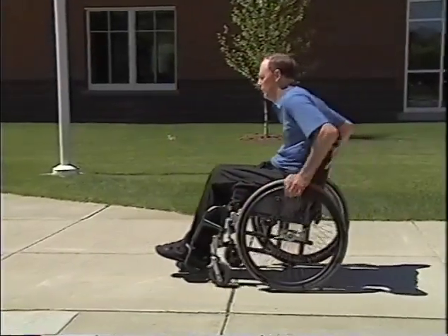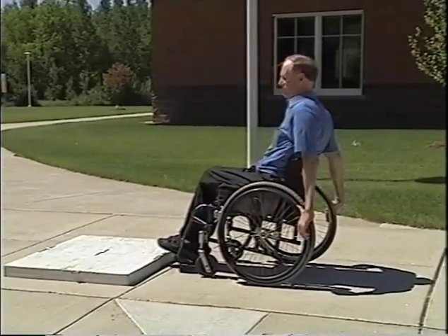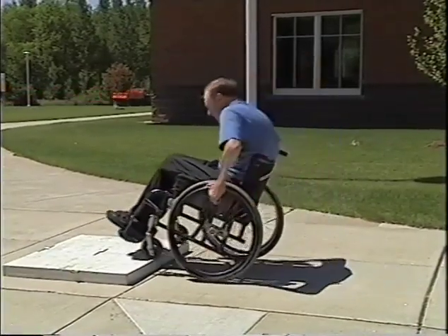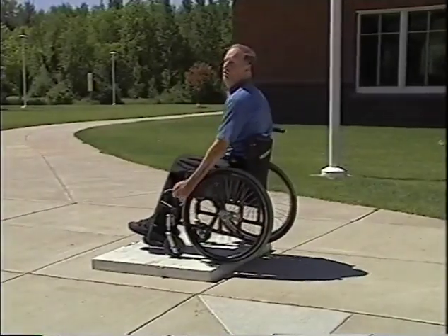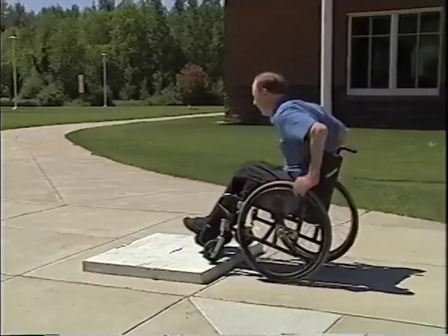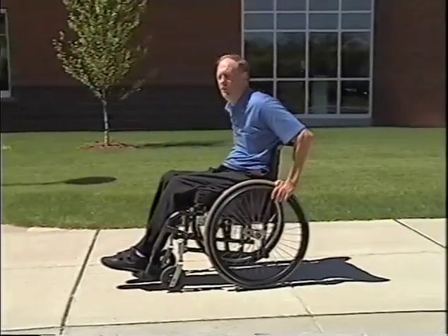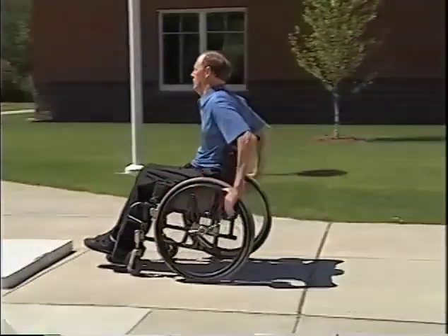So let's look at jumping up again. You want to be able to roll up right about here, leaning back, putting your weight back, and then pulling it over and finishing the job. And then falling off backwards. So it should be a very easy, natural thing, coming up to the curb.